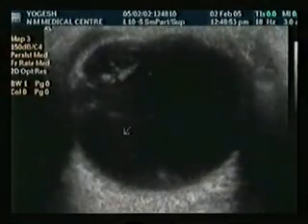This is a case of an intraocular foreign body embedded in the retinochoroidal layer. Note the extremely echogenic nature of this metallic foreign body, which entered the eye when the patient was hammering. You can see the shadowing in the orbit posterior to the foreign body, and the tract of the foreign body formed in the vitreous cavity from the site of entry, along with associated vitreous hemorrhage. This helps in planning treatment with vitrectomy, as we can locate the foreign body almost perfectly with ultrasound. A CT scan may also help in planning treatment.